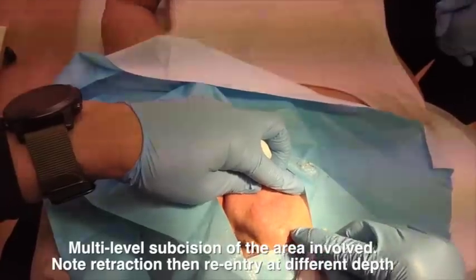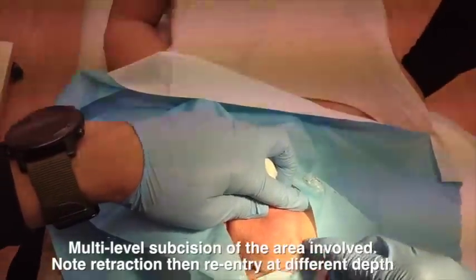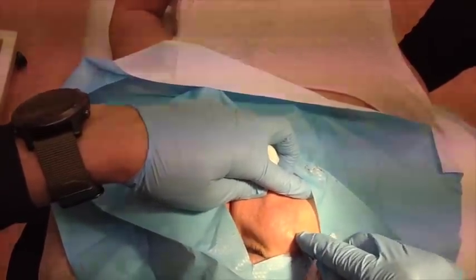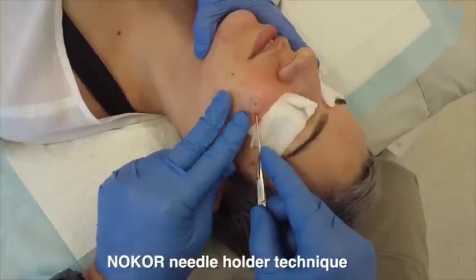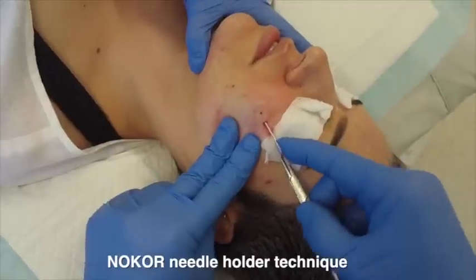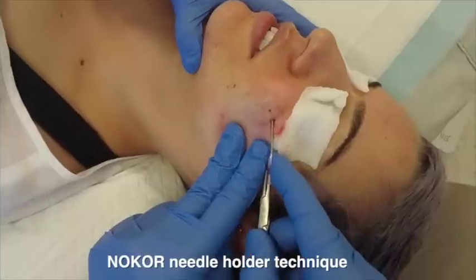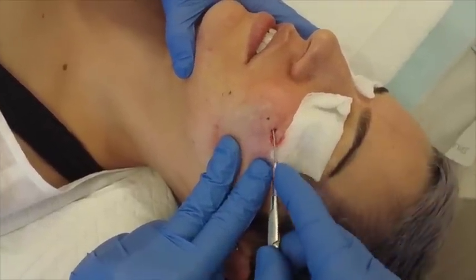I go in at different depths because I believe there are attachments at different depths. You can actually feel when it releases, then go down to a deeper depth — being very careful with the regional anatomy. This is why I think it's important to perform blocks. I'm much more accurate when there is very little tumescent anesthesia in the area. Tumescent anesthesia can help with safety, but I find it more accurate with a regional block.